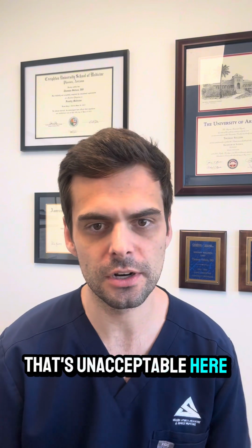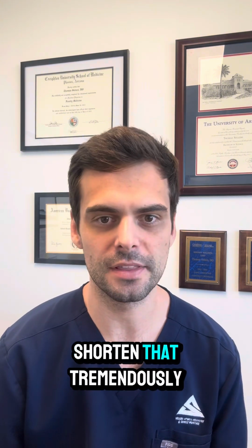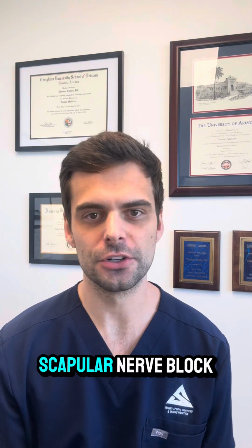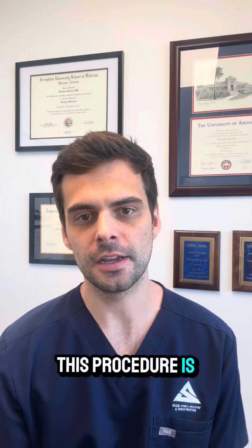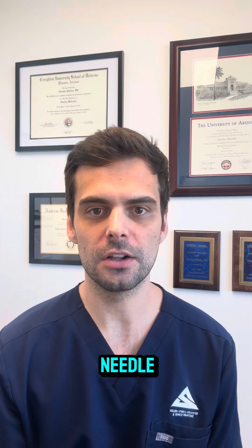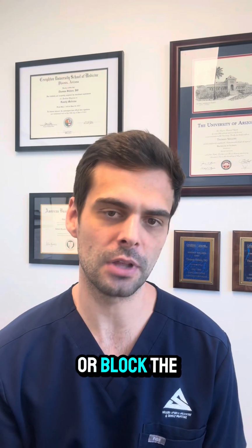That's unacceptable here at Sellers Sports Medicine. We got some really awesome procedures to try to shorten that tremendously. Let's dive in. First, I'm going to talk about the suprascapular nerve block. This procedure is, of course, under ultrasound guidance where we go in with a needle and inject lidocaine around the nerve. So we anesthetize or block the nerve.